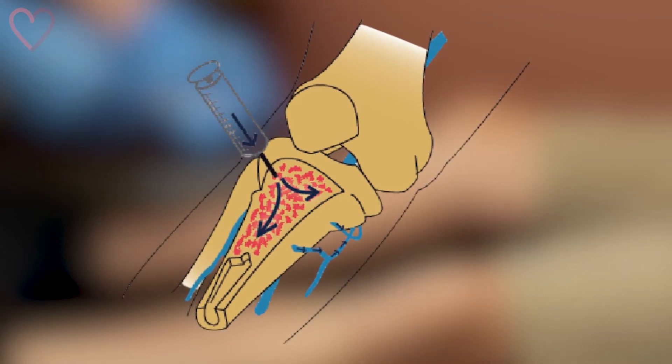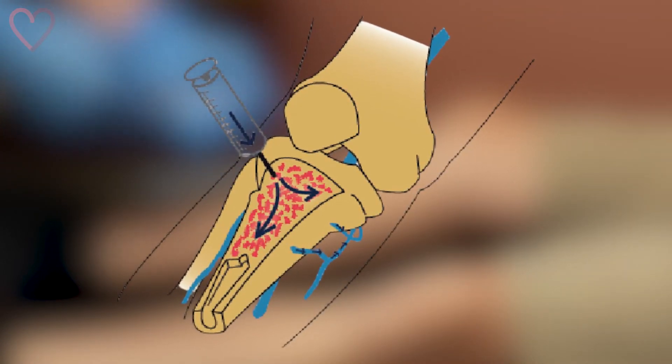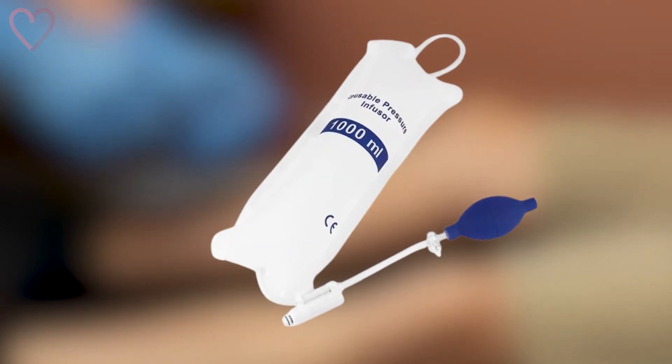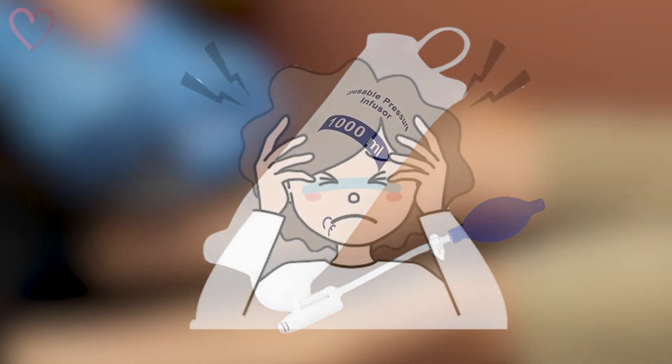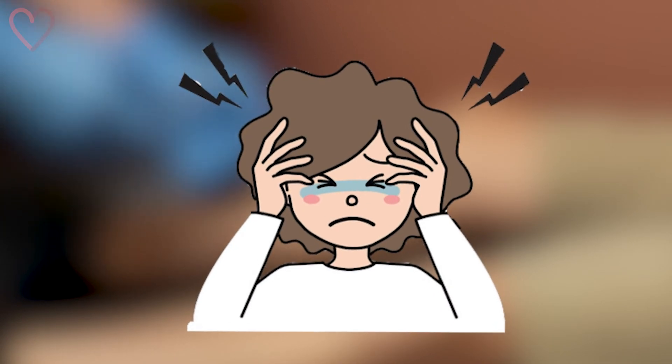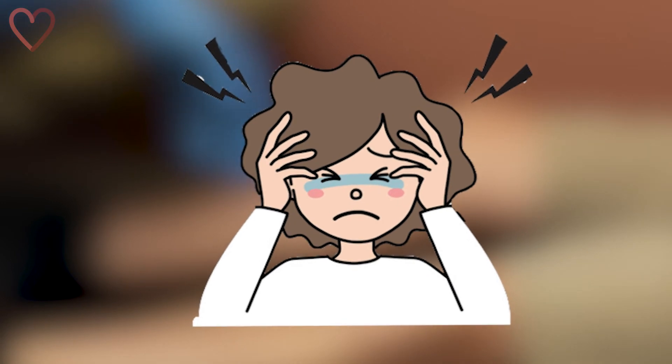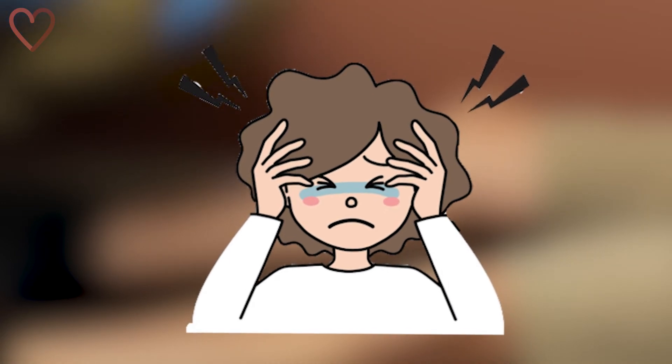However, if you're going to infuse IV fluids, you'll still need a pressure bag. This initial high pressure flushing is often considered the most painful part of the procedure. Therefore, using local anesthetics according to your local protocol is recommended in patients who are responsive to pain.